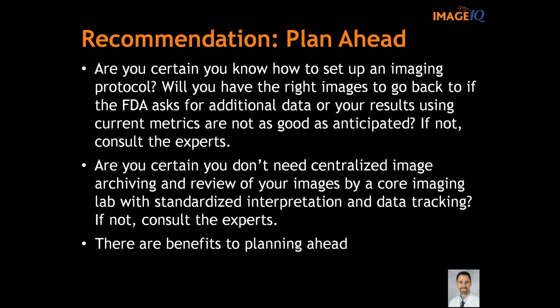So these are just recommendations about planning ahead. If I ask you, are you certain you know how to set up an imaging protocol? Meaning, do you need thin slices? How do you translate this across multiple different scanners, vendors, and sites? If you're not really familiar with that, that's a good chance for you to say, maybe I should get some help. Especially, what if this happens to you and you don't get the results that you were anticipating, and you're borderline, or you have a new drug and the FDA wants some additional data? Having the right protocol, deciding up front, do you need to capture the images or not, is a critical question. So get a consult on that.